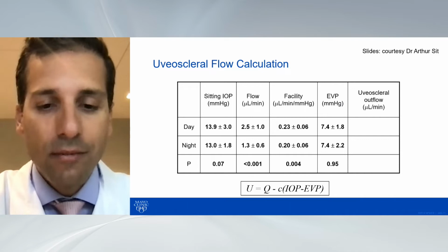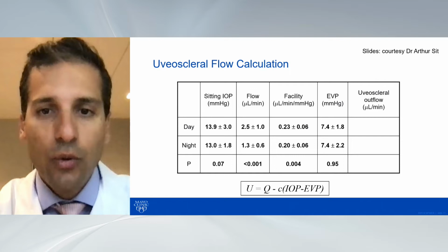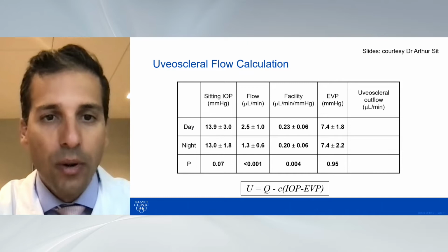However, our patients, and this is the next slide, are not averages. Patients behave differently. Next slide, please. And it's important to know our individual patients' IOP rhythm over 24 hours. Next slide. This is why having measures to measure IOP around the clock, either through a contact lens or through implantable devices, are so important. Next slide.